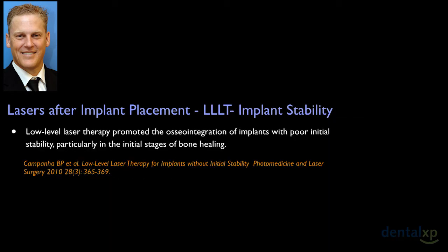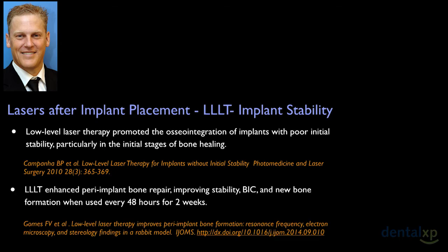So when we look at the low-level laser therapy, we have to ask ourselves, when would we want to use it? Well, perhaps in those cases where the implants have poor initial stability and we require improved bone healing in those periods. So they've used it every 2 days for the first 2 weeks and found an improvement in stability, bone-to-implant contact, and new bone formation.